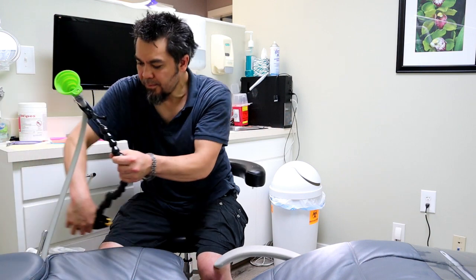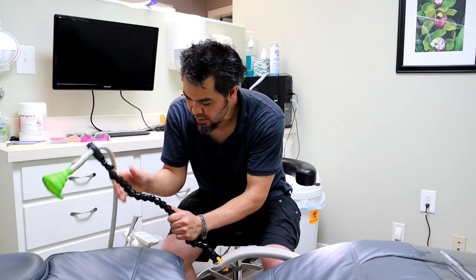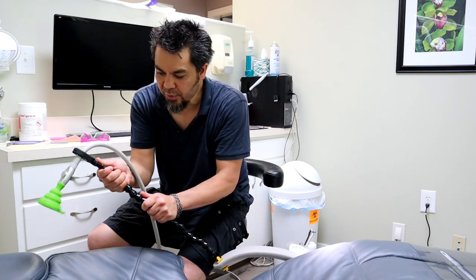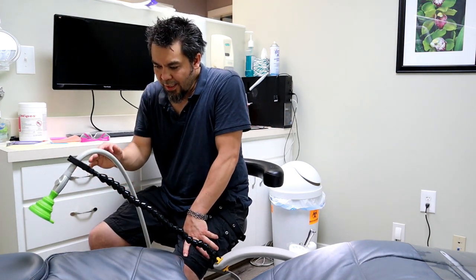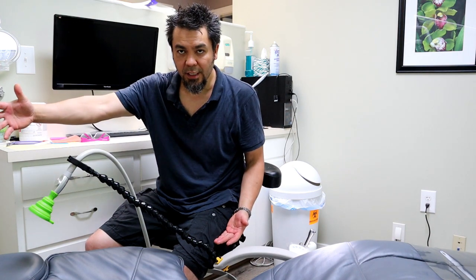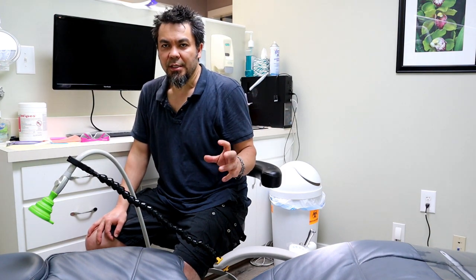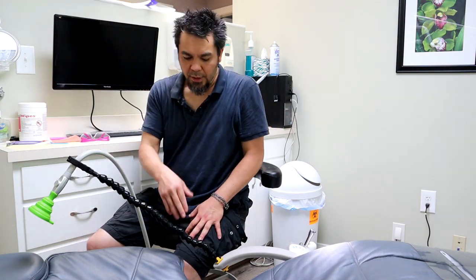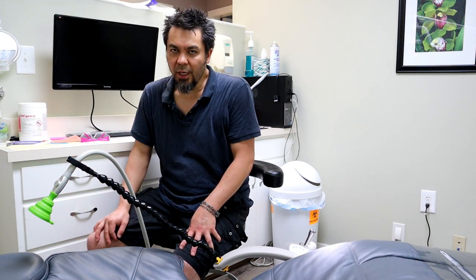Another attachment point to try is the armrest. On this particular chair, that's not a bad option and it's about in the right position. Depending on where the patient's head is, it may not go far enough back — we do sell extensions to extend the PLAMP further, but there's a limit to how much you can extend it. In my opinion, using the mic stand is a better option than extending, because you can guarantee it will work. But the armrest will kind of work in some cases.